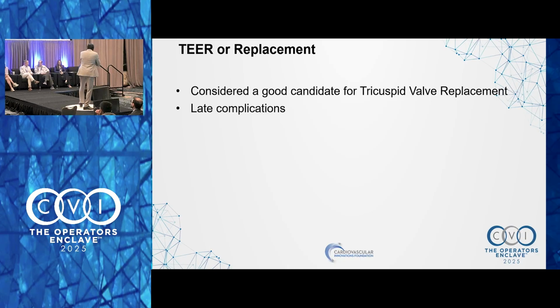Lucy? So a significant amount of TR, I think we'll all agree. And I agree with you, the gap or the width of that tricuspid regurgitant jet was pretty wide. Just eyeballing, it was at least 1 centimeter wide. So a pretty large gap, especially in that biplane view that you had. So TTVR would probably make a lot of sense for her as opposed to clip.